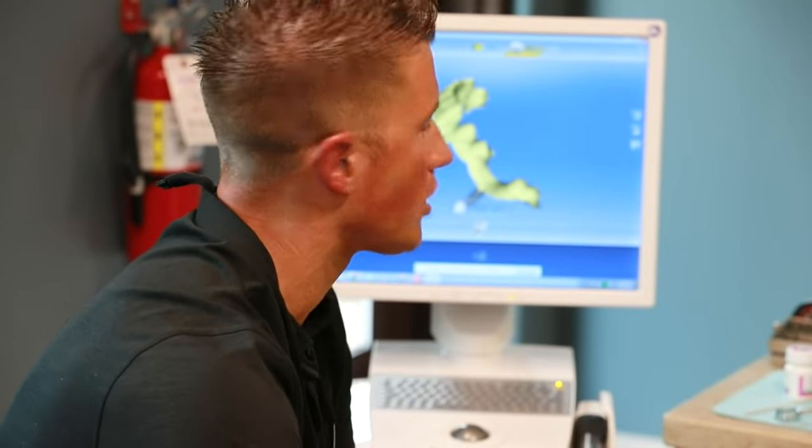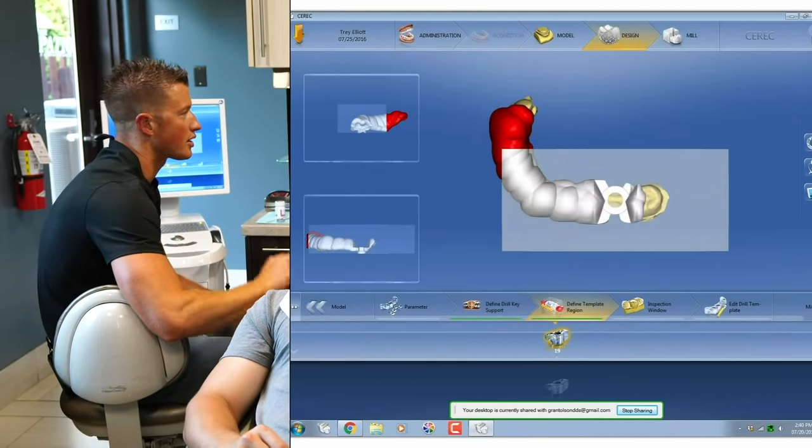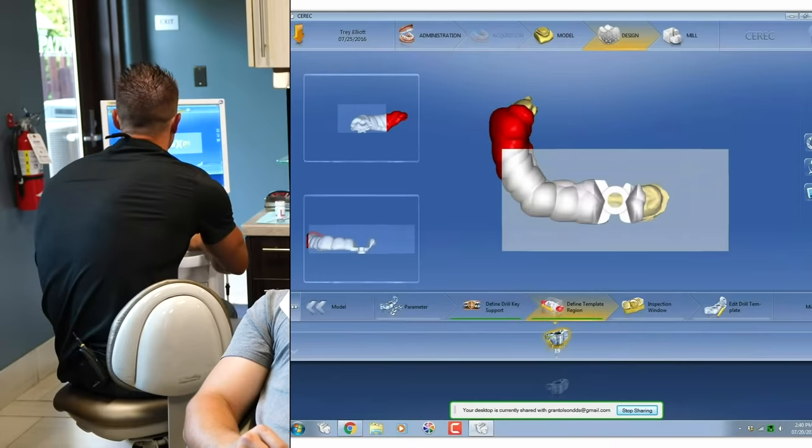So what if it didn't? And these windows I can use to make certain that the guide fits exactly like it should, and I'll show those before we place the implant. So if the windows are kind of like, what are you talking about, and you're not quite certain, I'll plan them here, but you'll get to see why they're present here in a few minutes, about 30 minutes after we make this guide. You'll see it in the arch.